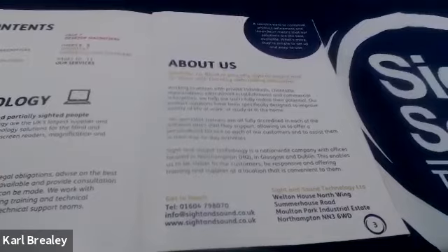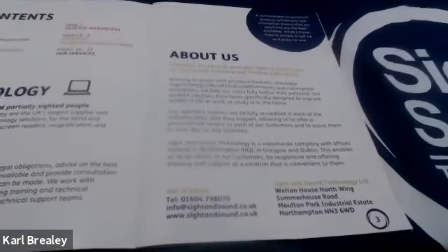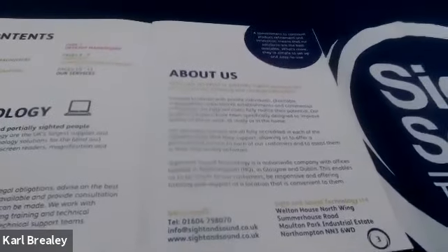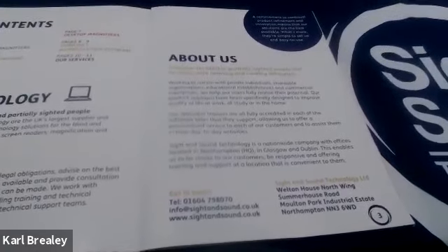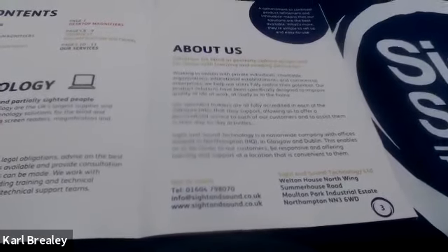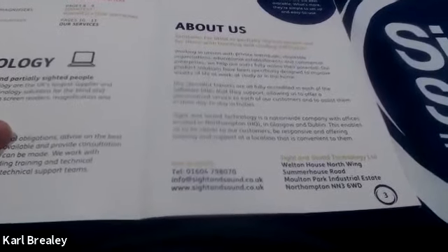Obviously, I don't suggest anyone steps out in front of a bus to take a picture, but yes, it would actually pick up on the text. It has no issues picking up on the text at all. Don't get me wrong, there are limitations to everything, but the way it scans, if you can take the picture quick enough, it's snapped within a millisecond. So it has the ability to pick it up. What was your first question again? Sorry, I do apologise.